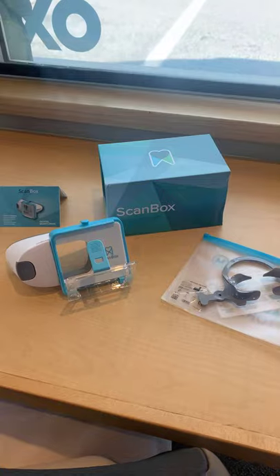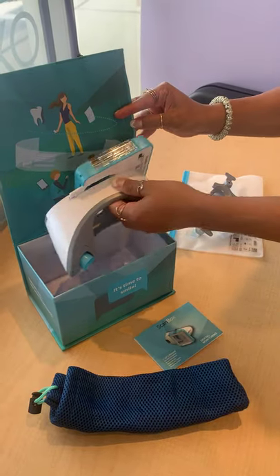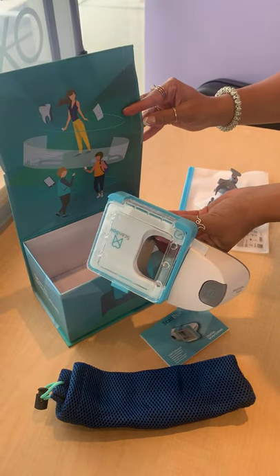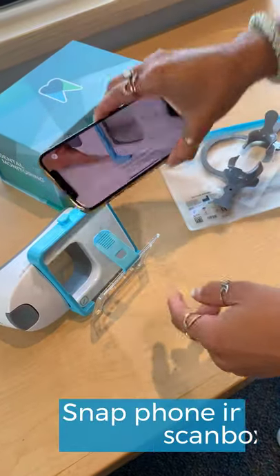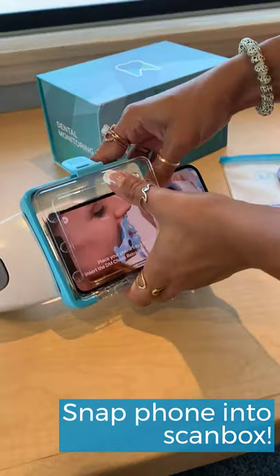First, open up your dental monitoring package and take out the scan box. Snap your phone into the scan box and hook it in with the strap. Get your app ready to start the scan and make sure the screen is facing outward.